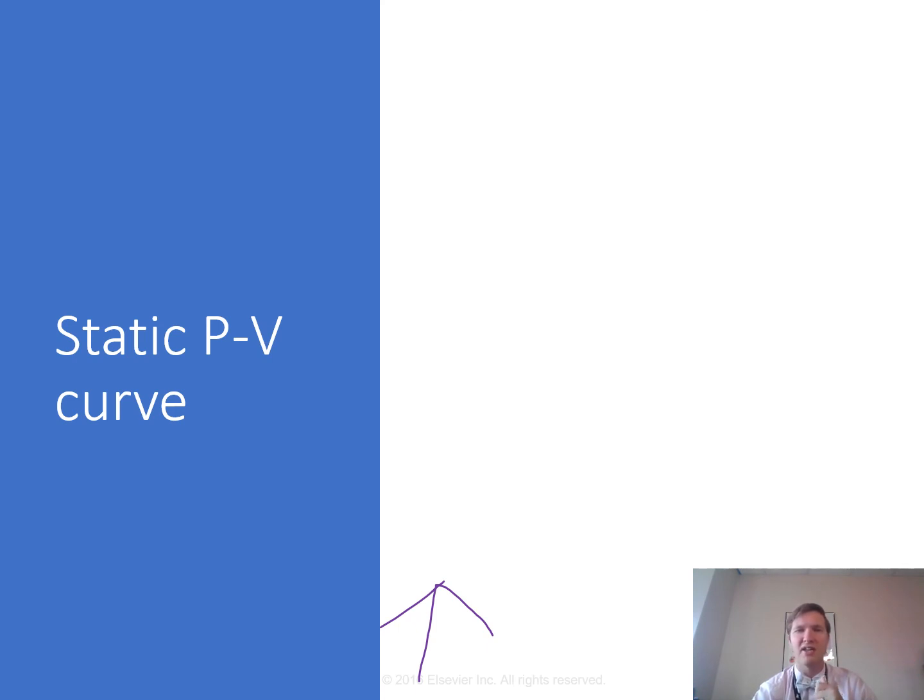So we should assess the clinical data to help make sure that we're not causing an issue. Looking at that inflection point might really help us avoid causing harm to a patient, and it could help us give a lot more detailed information. Now, obviously, I have a whole ventilator graphics PowerPoint talking about this, but Chapter 9 really includes an overview of ventilator graphics along with examples. Additional information about the mechanics is going to be a whole separate chapter, but specific procedures for obtaining and using a PV curve change, especially for patients with ARDS. So make sure that you're using the appropriate settings, and using vent graphics can be very helpful in making sure you have appropriate settings.